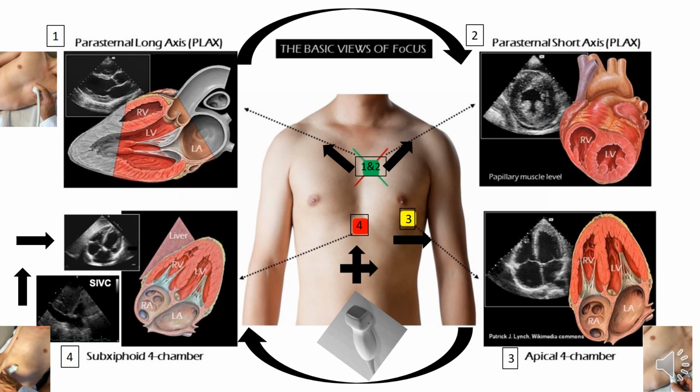According to the tilting of the probe, we might cut the left ventricle at the apex or at the mid segment, as shown here at the level of the papillary muscle. Tilting more upward, we will get a cut at the level of the great vessels. What is shown here is at the level of the papillary muscle, or mid ventricular level.